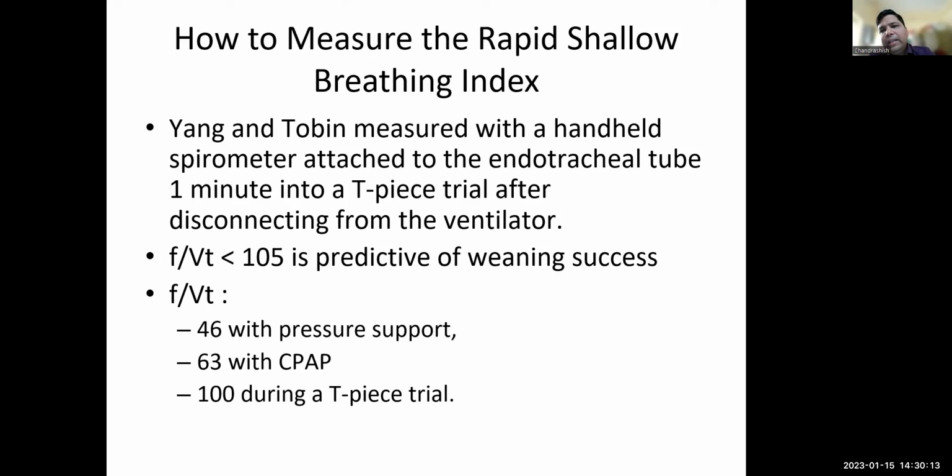Now, one of the weaning indices that has stood the test of time and has been largely talked about is called RSBI, or Rapid Shallow Breathing Index. Now, what is a Rapid Shallow Breathing Index? This was first described by Yang and Tobin. Yang and Tobin basically attached a handheld spirometer to the endotracheal tube one minute into a T-piece trial after disconnecting them from the ventilator.